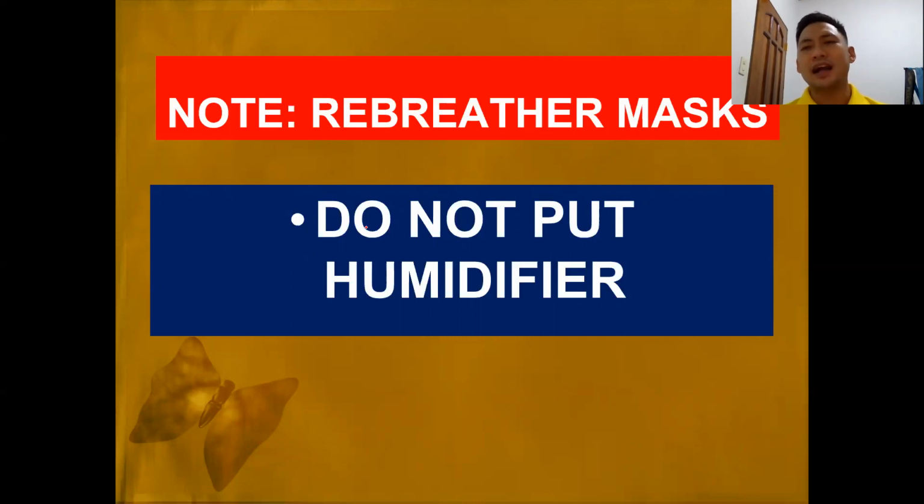If the patient is not improving with other oxygen therapy devices, and needs a rebreather mask on a long-term basis, then we could possibly use other advanced treatments such as endotracheal tube insertion, which can be attached to a resuscitator or a mechanical ventilator. Okay? So the rebreather mask should not be used for long.